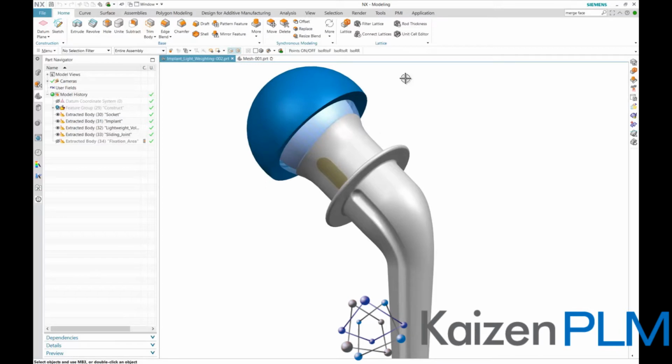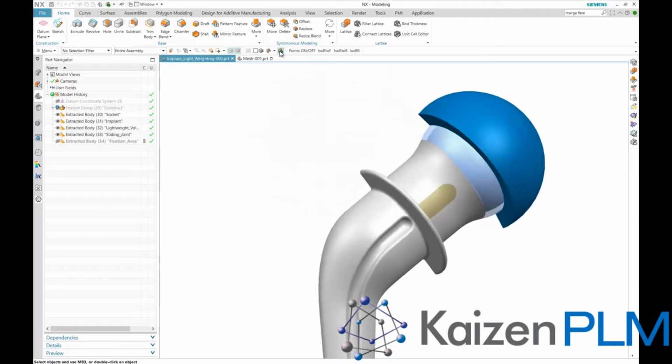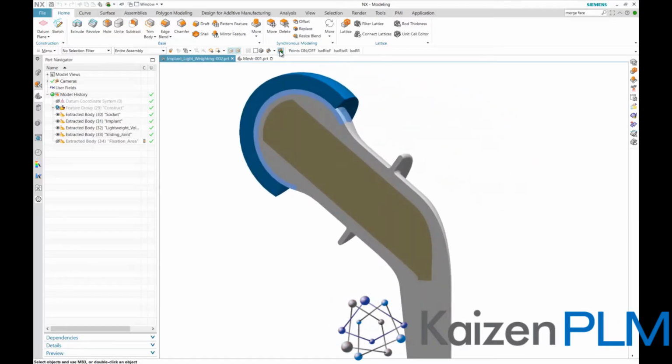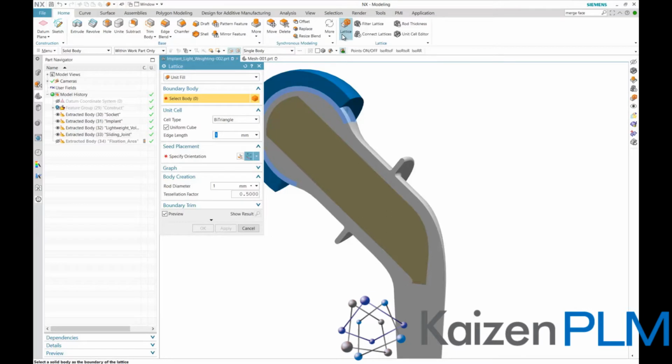Zooming into the area we want to modify, we turn on the sectioning to show all the parts of the implant. The sectioning also reveals a cavity inside the implant, here represented by the beige part. It is this cavity volume that we will use for our initial lattice. We also note that the cavity is not quite following the exterior shape, and there is a reason for that we will look into in more detail later on. So let's get started in creating our first lattice.